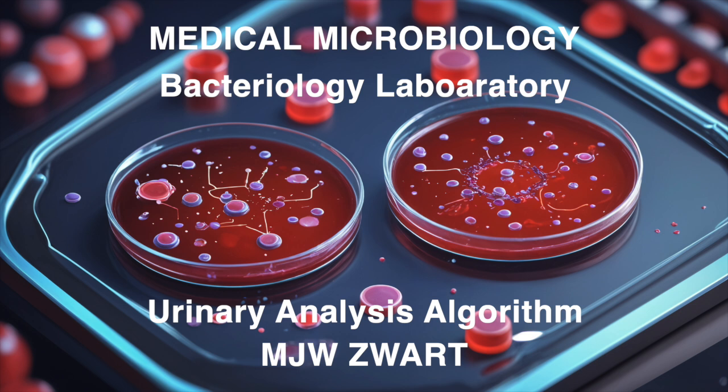Oh, yeah. For instance, they have very specific guidance for handling ESBL and carbapenemase-producing organisms, as well as MRSA. Wow. These are some of the toughest bugs we encounter in the lab. They are. And having clear protocols for detecting and confirming resistance is essential. It's like having a specialized playbook for each of those notorious superbugs. Exactly. And they don't shy away from acknowledging that even our sophisticated automated systems like the Vitek 2 have their limitations.